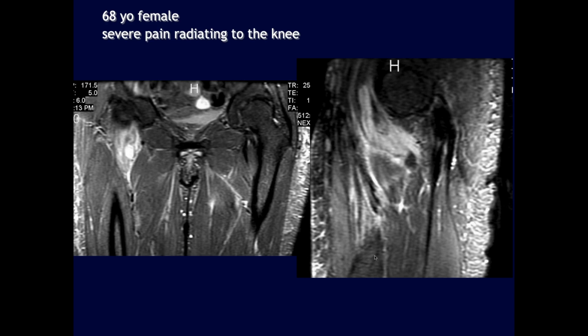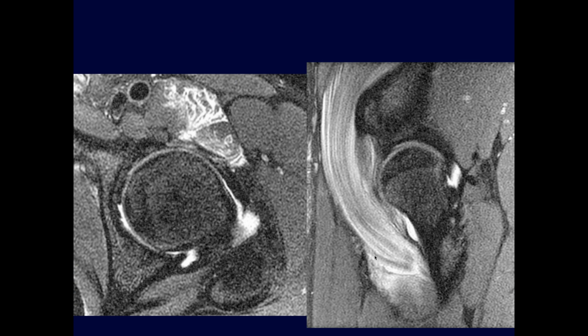You don't see any fibers that are torn, do you? Just the edema along the fiber tracks, right? That's all I see. So interstitial edema from a strain, grade 1, if you want to grade it.